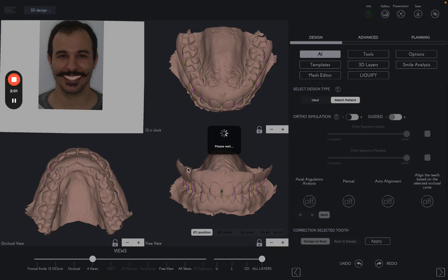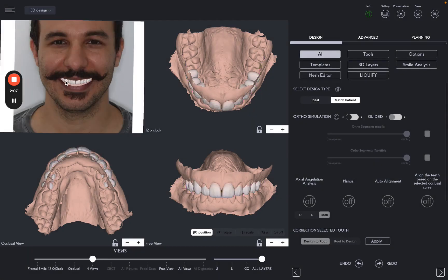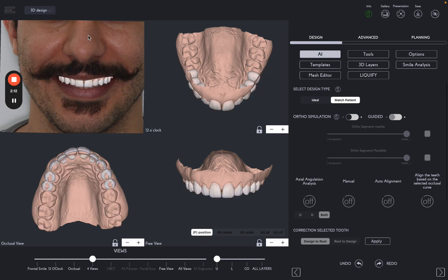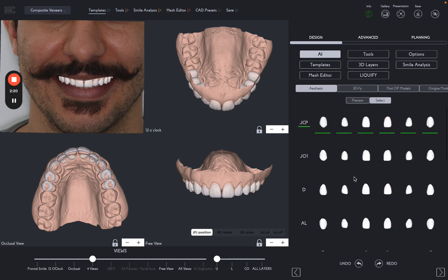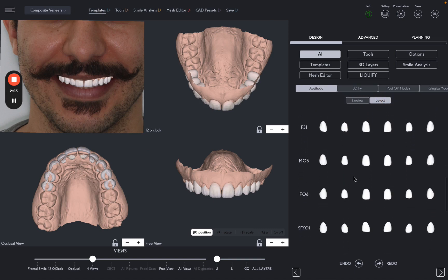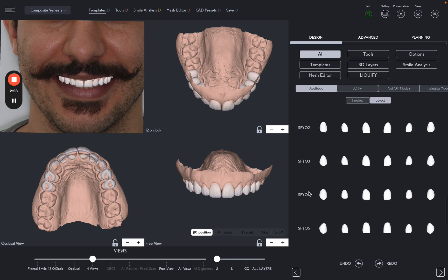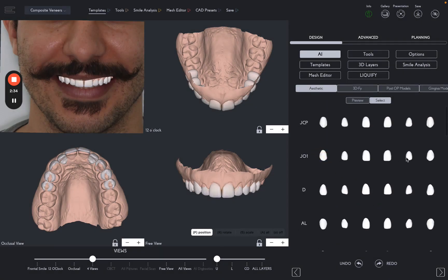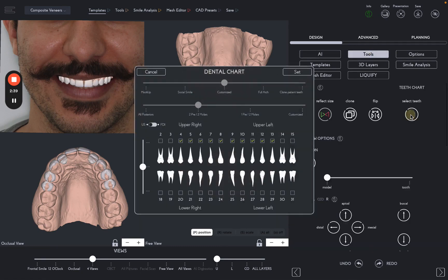Wait for the AI to generate the 3D design. We can now select the Composite Veneers type of restoration. Choose the template that best matches the patient's existing teeth or facial proportions. Then choose the number of units you want to design.